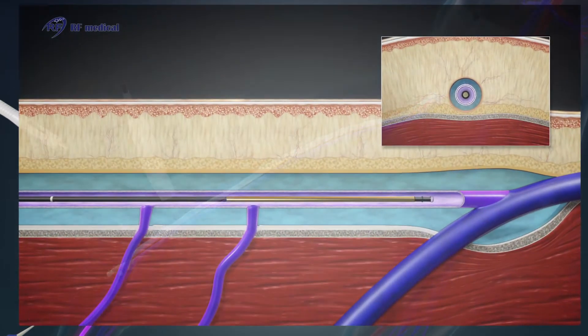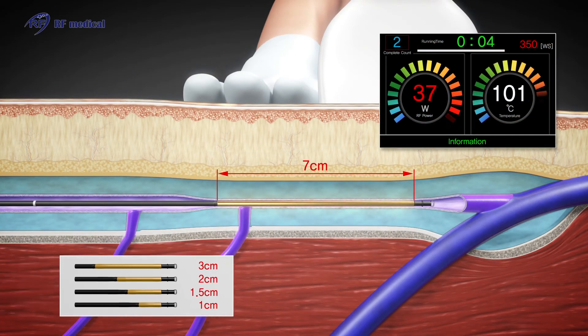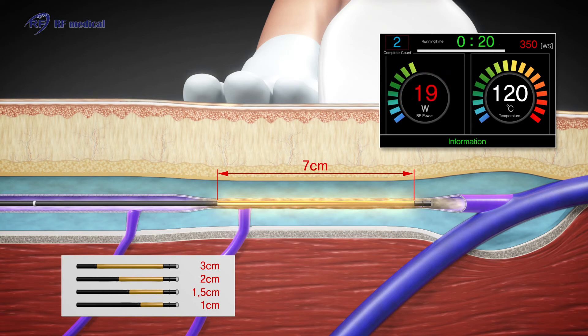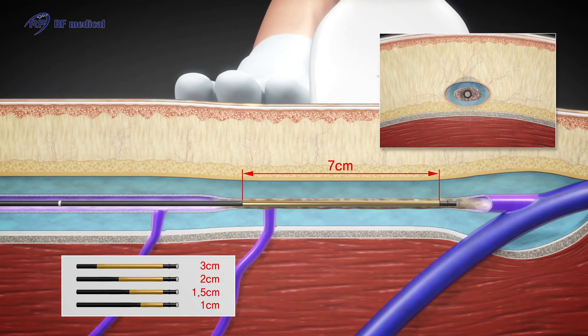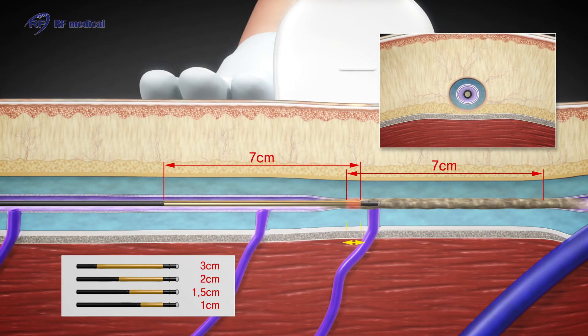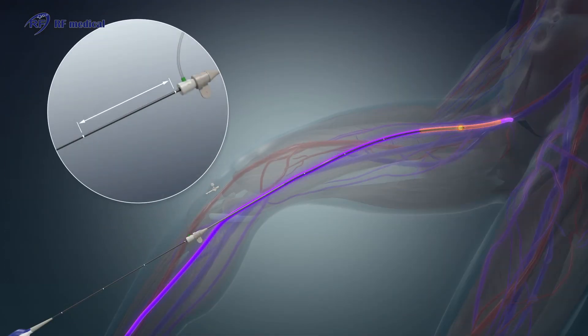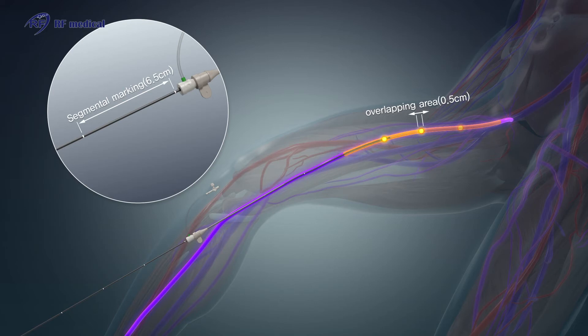After tumescent anesthesia, a little compression is needed to compress the vein. The first ablation is done twice. The VeinClear system catheter has various sizes of heating coil and offers segmental ablation. It also has markings on its shaft, and segmental ablation can be done by following those markings.